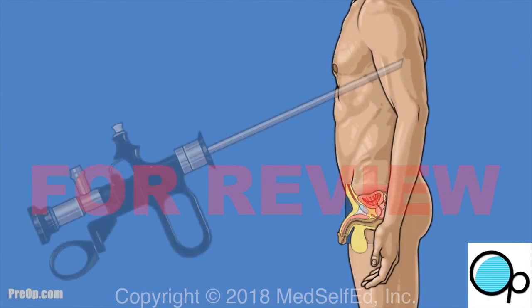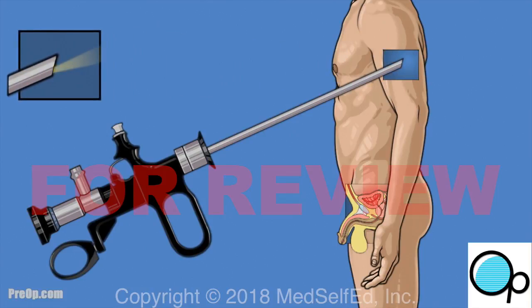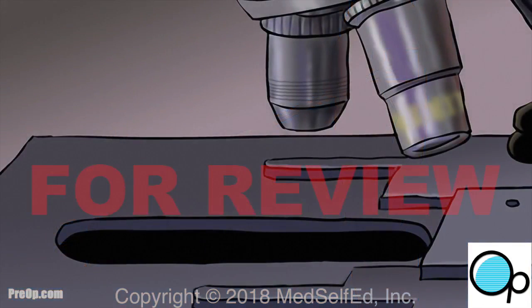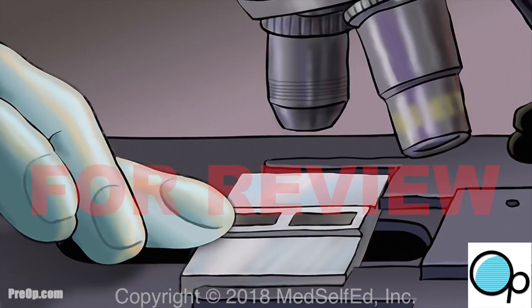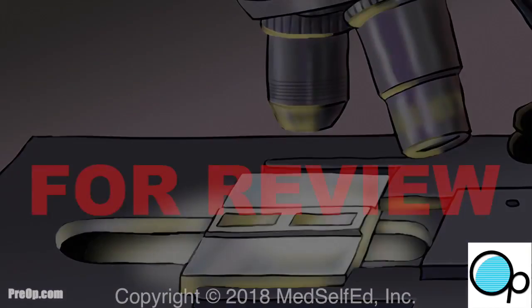With a TURBT, or transurethral resection of bladder tumor, a surgeon uses a scope to look at the bladder lining and remove the tumor. A scope is an instrument with a light and camera. It has a loop at the tip that can cut with heat energy. The tumor is sent to a pathology lab for examination. Further treatment may be needed in the future after this surgery for your cancer. These plans are made if needed after the procedure and based on the final lab results.